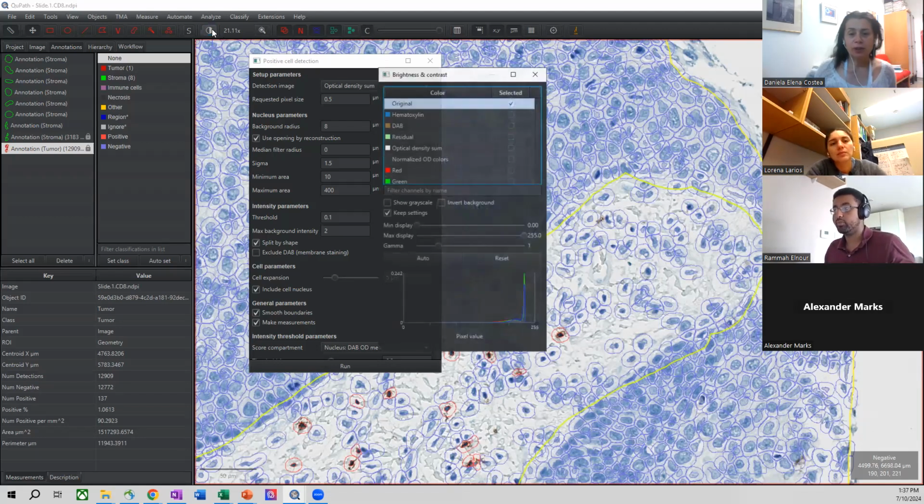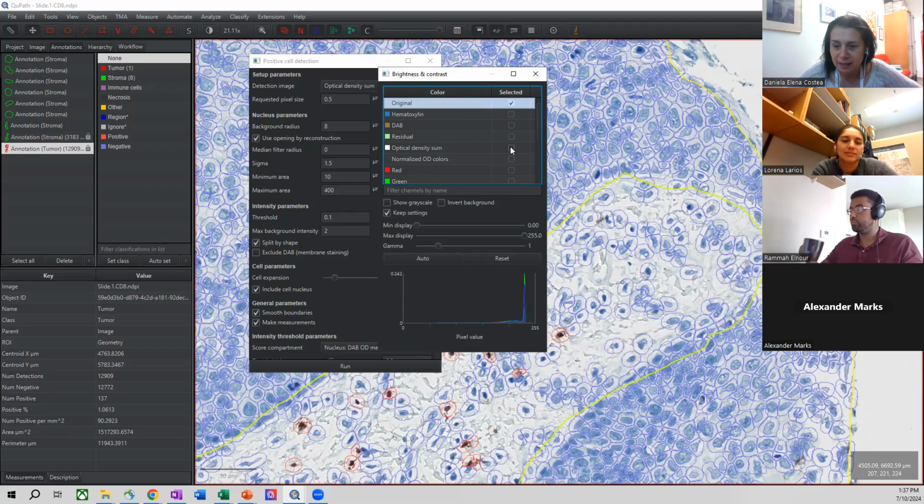Just a second, because Alexander lost us. He got a black screen. Something strange happened to my screen also, but mine managed to come back. So let's see if he's back. Yes.